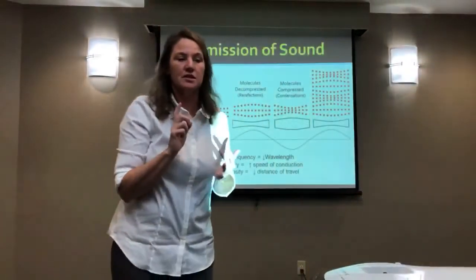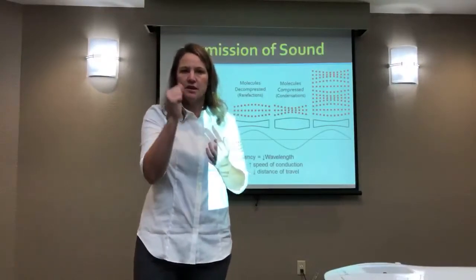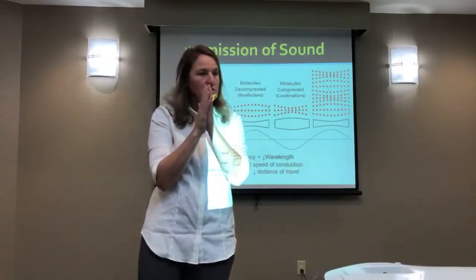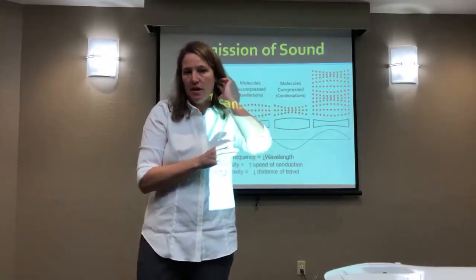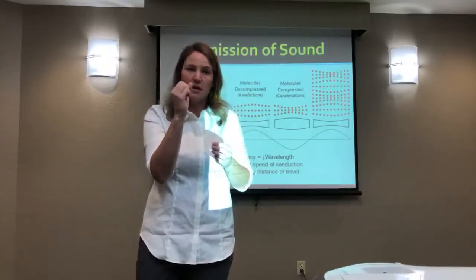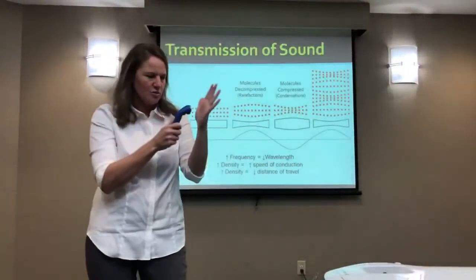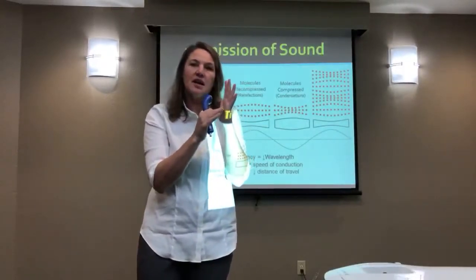The higher the frequency, the shorter the wavelength. Does that make sense? If it's a higher frequency, it's going to go smaller. To be that fast, the length of the wave goes smaller. In the range that we're talking about, 20,000 hertz and above, you need a dense medium. The higher the frequency, the less the excursion of movement is going to be, and the more dense the medium needs to be. So I could turn on my ultrasound, get right close to the body, turn it as high as it'll go, and that energy cannot get to you.